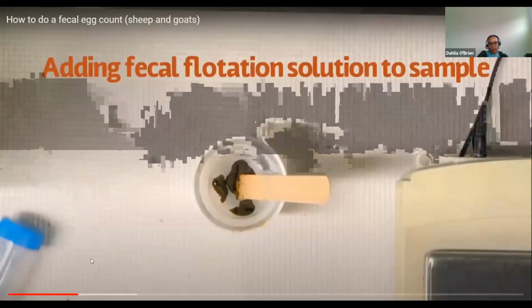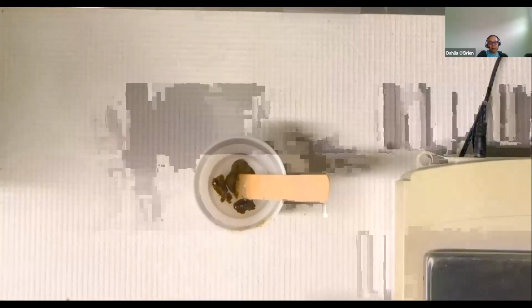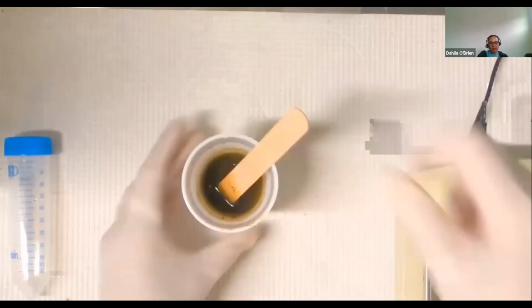So I have my 4 grams of fecal matter, and now I'm going to add 26 mils of my salt solution. And again, remember, for 4 grams of feces, the magic number is 30 mils. So if we estimate 1 gram of fecal matter is 1 mil, then 4 grams would be 4 mils, and so I only have to add 26 mils of solution. I'm using the tongue depressor to really break up that fecal pellet. Remember, those parasite eggs are inside that pellet, and I need to break it up to get the eggs out.